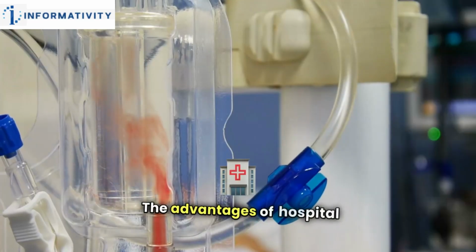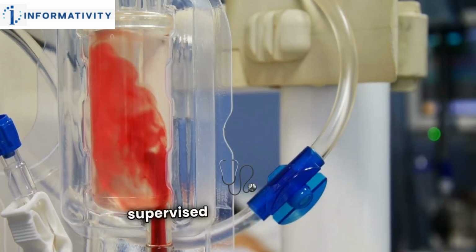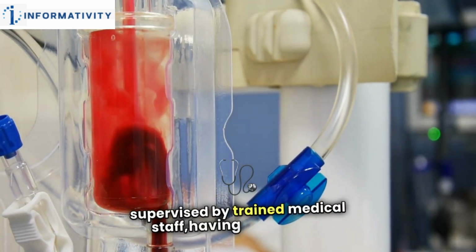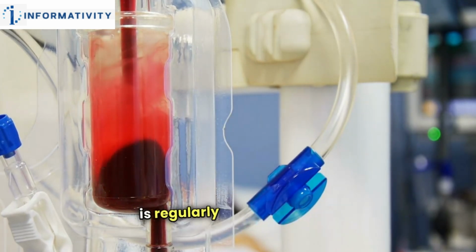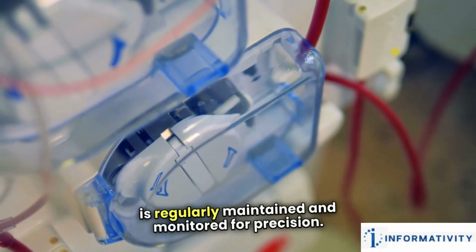The advantages of hospital dialysis include being supervised by trained medical staff, having emergency care readily available, and ensuring that equipment is regularly maintained and monitored for precision.